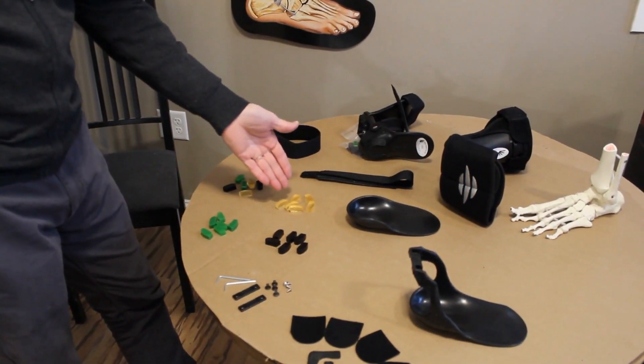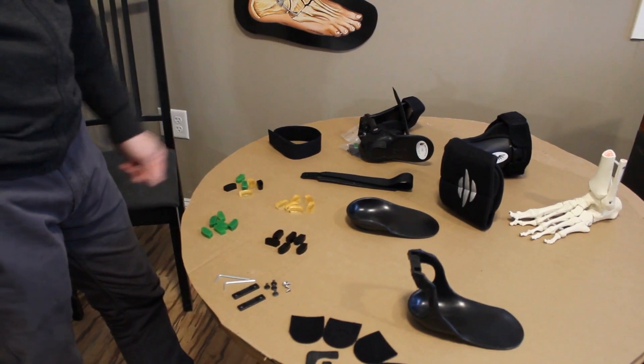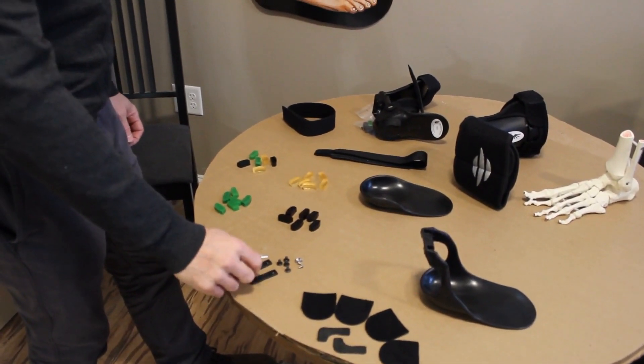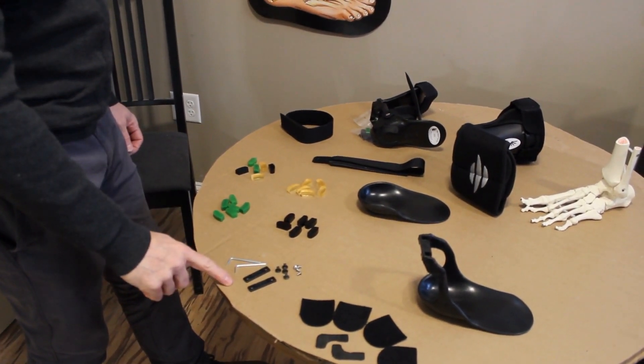You can order just amber, you can order black, you can order green, or you can order the variety kit. These are the tensors — they come with the two allen wrenches and the screws to replace the tensors.